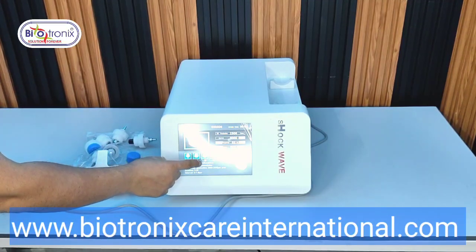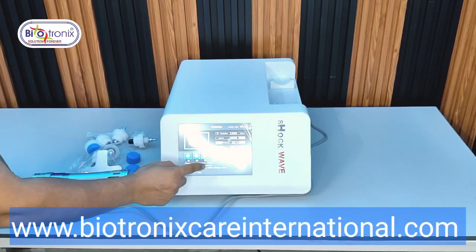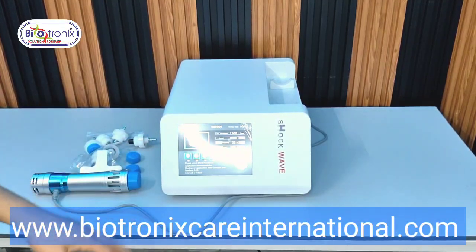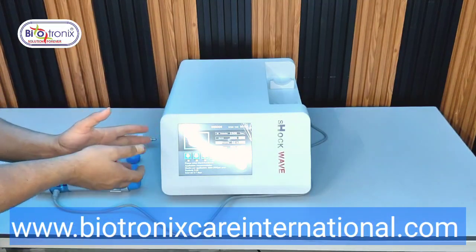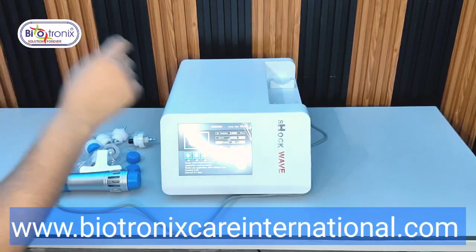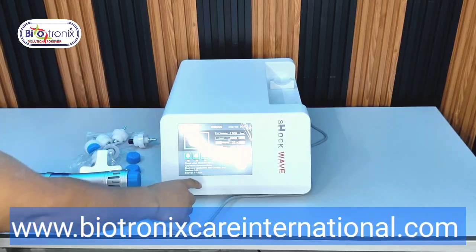These are the recommended ones. So as written over here also, please select the second and third hand piece, because these are recommended, hence in the yellow color, and the rest are not recommended, so they are in the white color. However, you can use them according to your need and the doctor's experience, but these are the recommendations. And application recommendation: shocks 2000 to 2500 per area, session 5 to 10 days, interval 5 to 7 days.